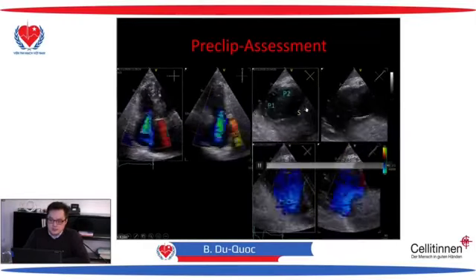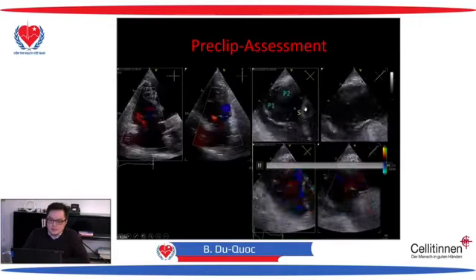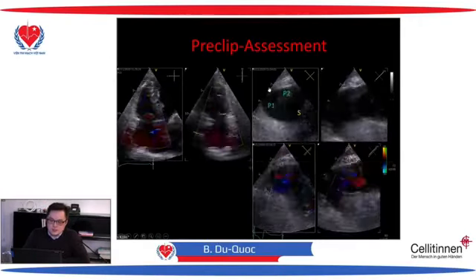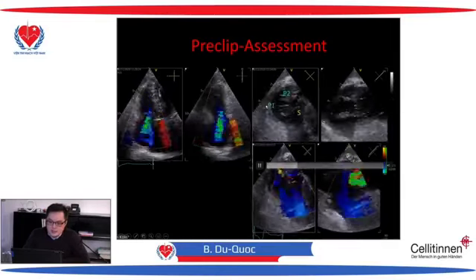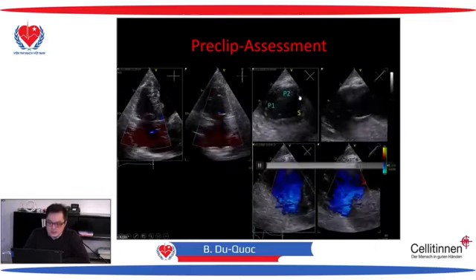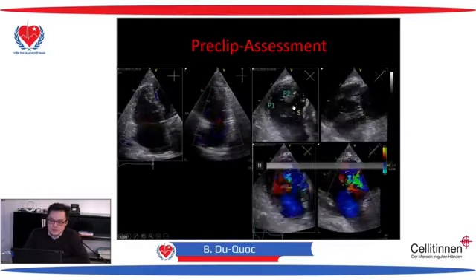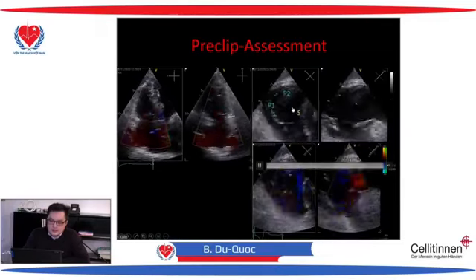And if you look here, you see this is maybe a little bit enlarged. Here is our 4 centimeter, this X. So you see there's a little bit of dilatation of the free wall, and you see here a smooth coaptation gap along the septal leaflet.